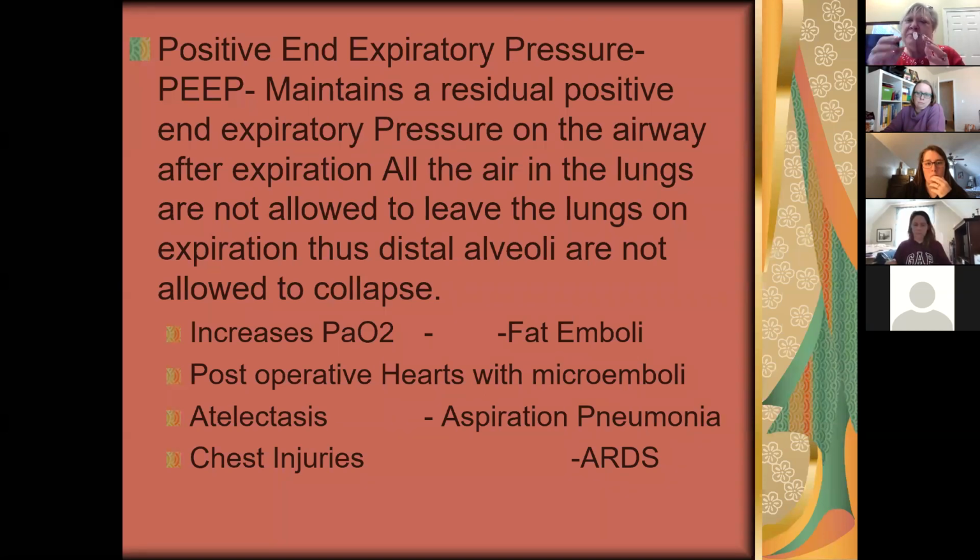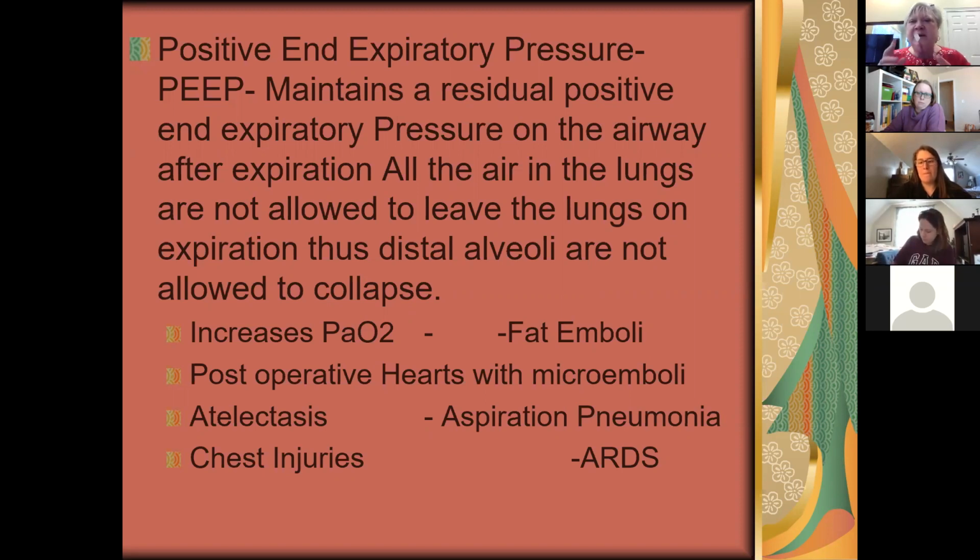But you know what? Let's give them just a little bit of pressure so that they don't have to work quite as hard. It's almost like giving them a little bit of oil for a squeaky door, or a little bit of oil so that when you go to lift the hood of your car, if there's not a lot of oil, that car hood can be a little bit heavy, but you oil that hood and that hood lifts a little easier. Well, they've got to open and close all those airways, and that pressure support just lets those airways open and close just a little bit easier so that their work of breathing isn't as hard.